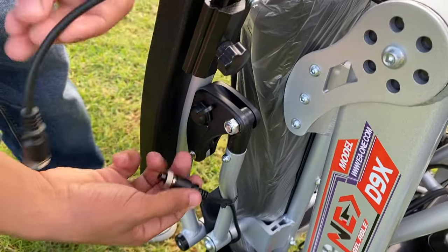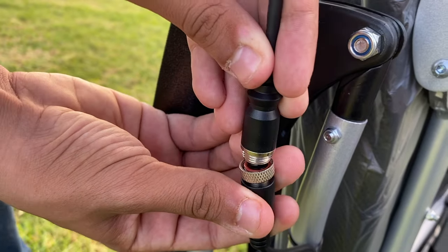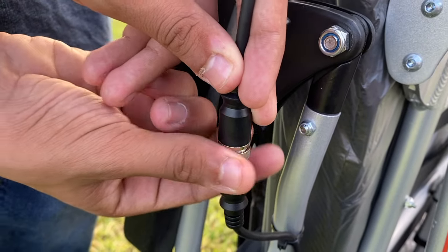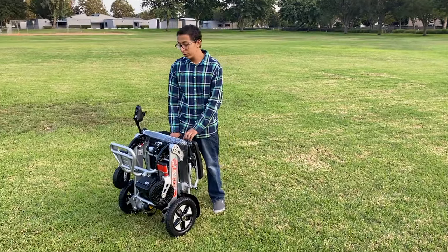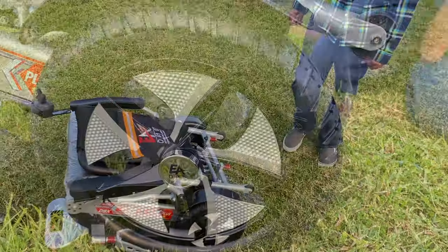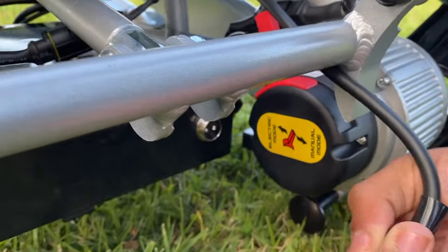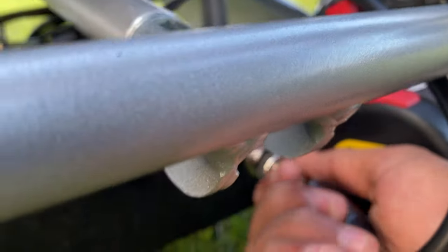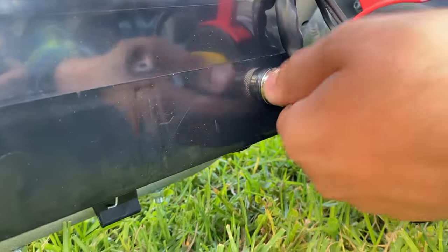Connect the joystick right here. Then carefully lay your wheelchair down. Put your joystick into your battery and screw it in.